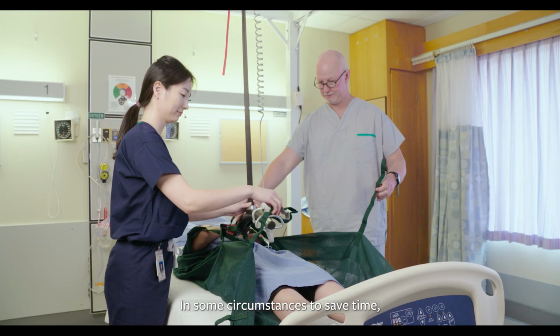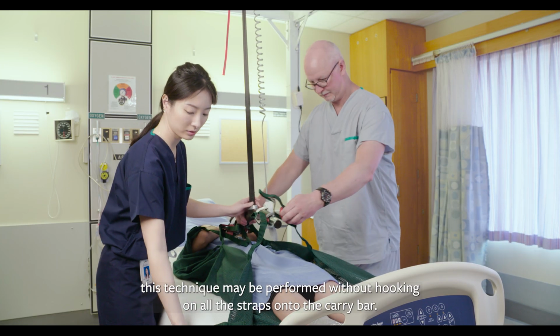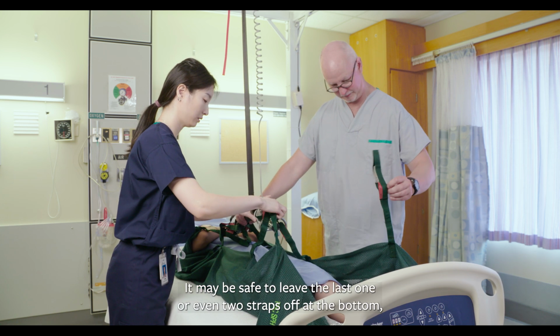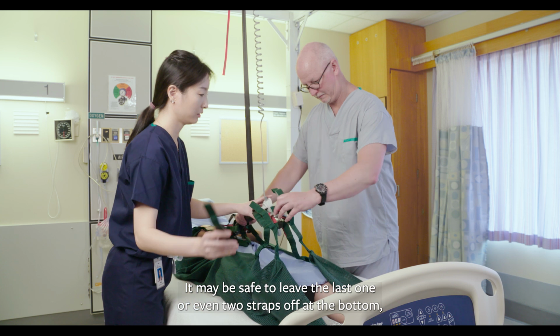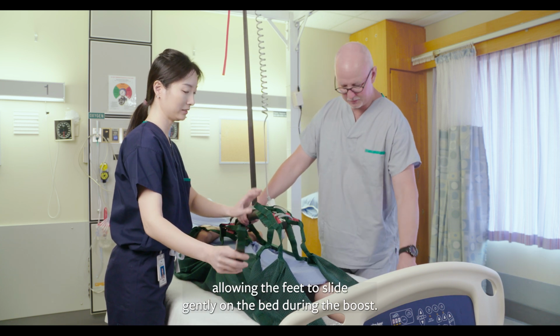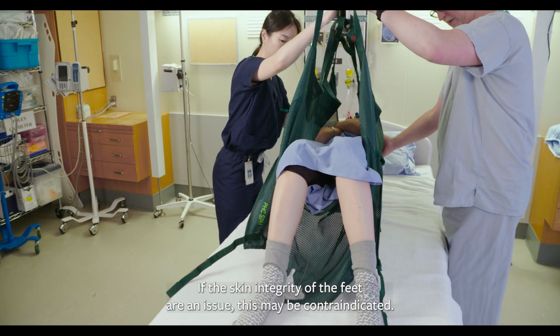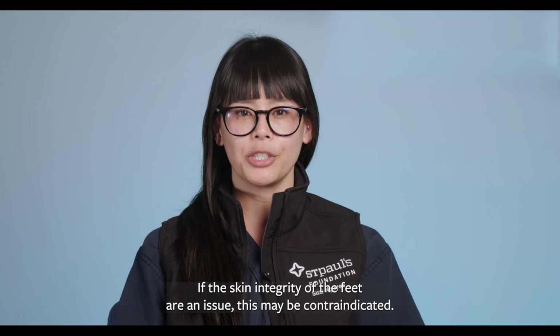In some circumstances, to save time, this technique may be performed without hooking on all the straps onto the carry bar. It may be safe to leave the last 1 or even 2 straps off at the bottom, allowing the feet to slide gently on the bed during the boost. If the skin integrity of the feet are an issue, this may be contraindicated. Please use your clinical judgment or consult with your wound care specialist team.